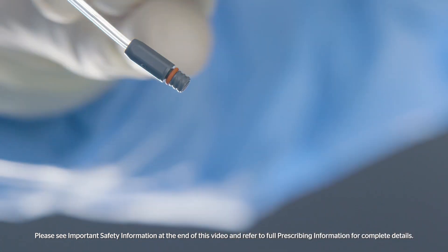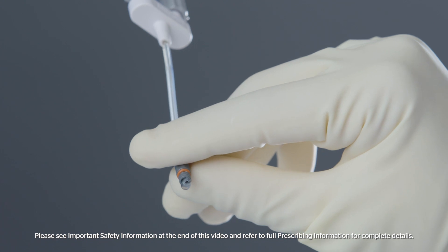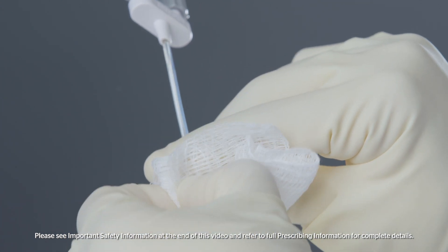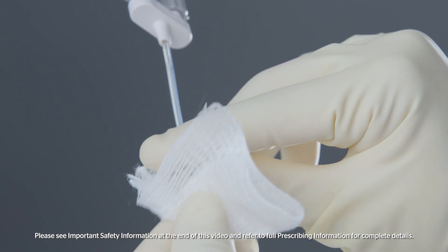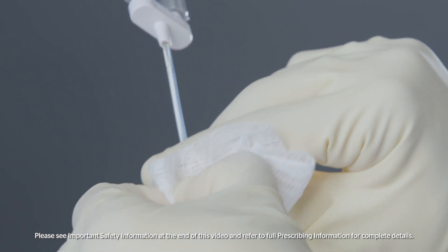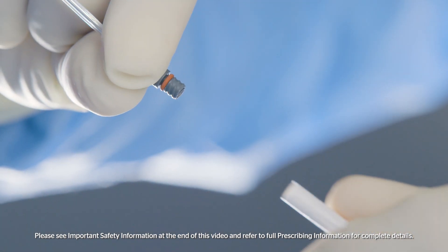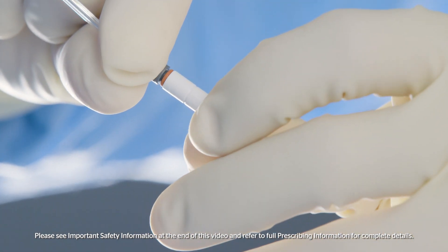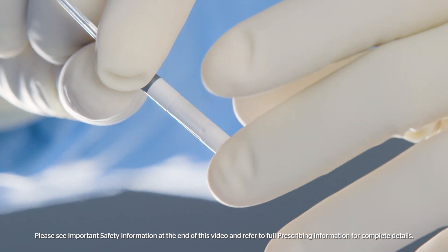Wipe and pull away any clots from the end of the tip with dry or moist sterile gauze, making sure you are pinching the clot and pulling away. Do not depress the clot deeper into the threaded tip connector. Visually inspect to see if the clot remains. Connect a new airless spray tip by twisting clockwise, ensuring it is securely tightened before use.